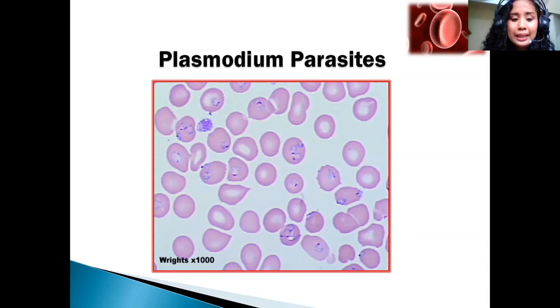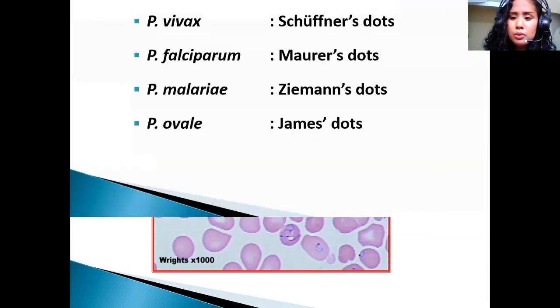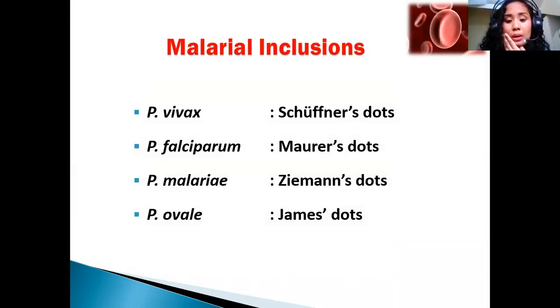So there are apparently inclusions. Actually, this is a good smear because many red blood cells are infected. But usually, class, commonly, not all. It's very difficult to diagnose a malarial patient if you're just using the microscope, but it's the gold standard. Still, microscopy is the gold standard. Now we have immunologic tests for Plasmodium, but it's still the gold standard because of malaria.